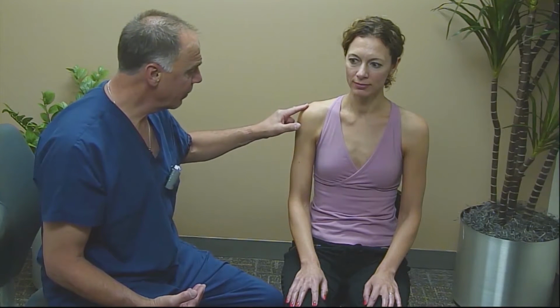Hello everybody. Today we're going to start with evaluation of the shoulder. When the patient has the arm in the neutral position, a lot of the pertinent anatomy that we need to evaluate by ultrasound is hidden by some bone structure, primarily the acromion and the coracoid process. In order to evaluate the soft tissue structures that lie underneath these bone structures, we're going to have to do some dynamic maneuvers of the arm in order to bring that anatomy out for easier viewing.